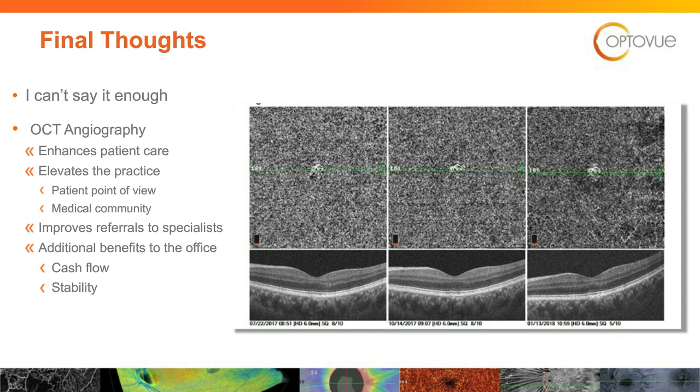First question, how does OCT aid in the diagnosis of optic nerve head drusen, Plaquenil maculopathy? OCTA for Plaquenil maculopathy isn't the best here for that. You would want to go to the B scan. The Plaquenil maculopathy is more of a structural change rather than a vascular change.